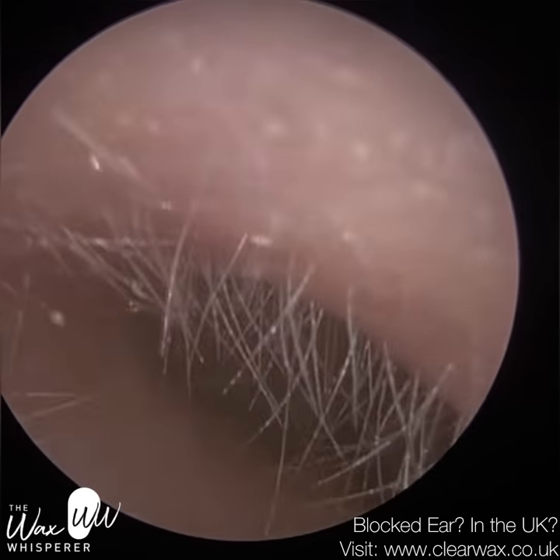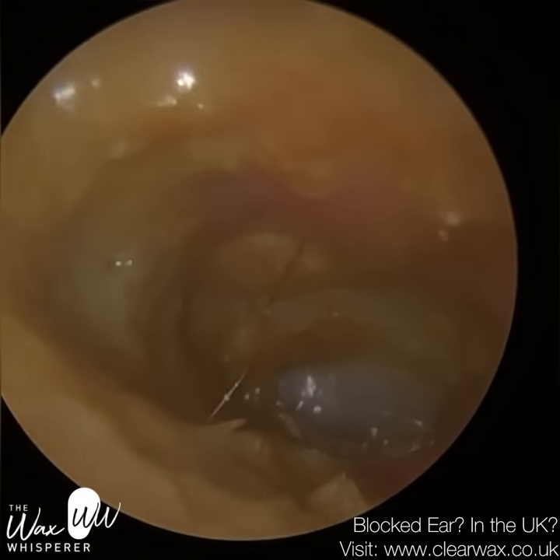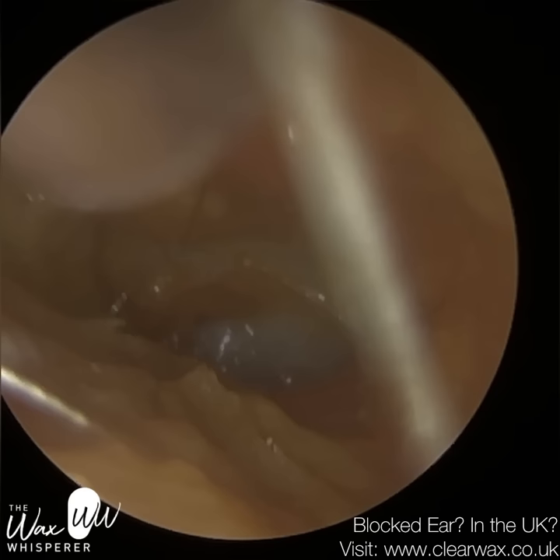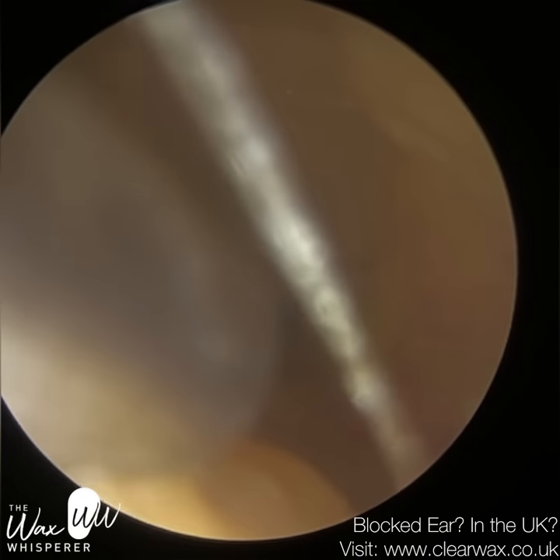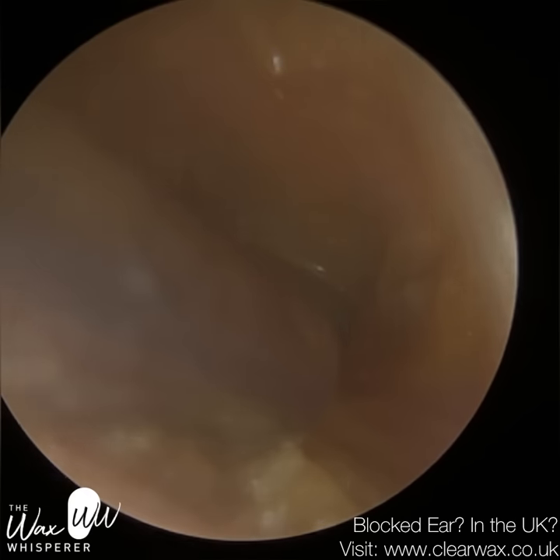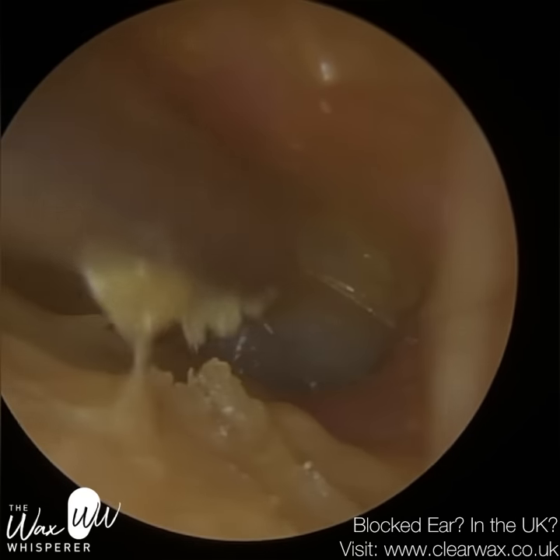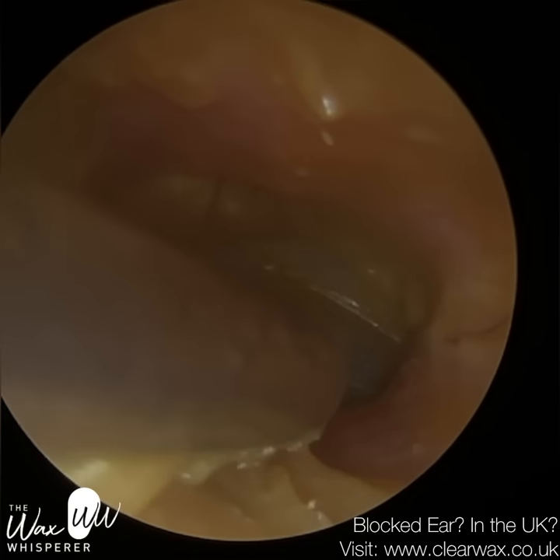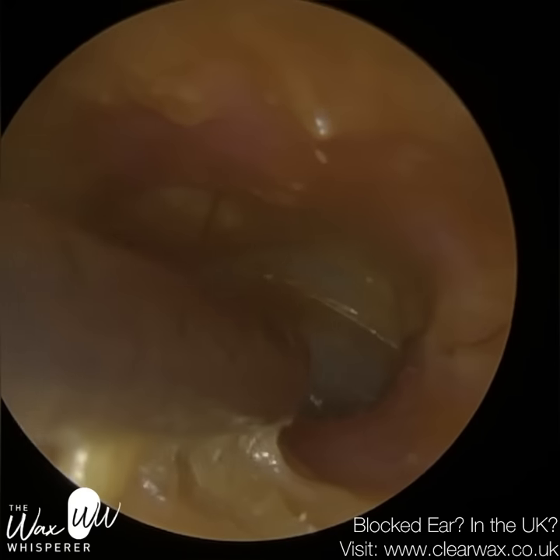The patient is already aware that we're not going to remove all of it, and truth be told it's not really going to make much difference — this patient's going to have to return. It's a chronic condition. Even if we left it at this, the skin's going to develop again, which would mean they'd need to come more regularly. The idea now is just to get as much as I can, so it just prolongs the next appointment, even if it's by a few weeks.